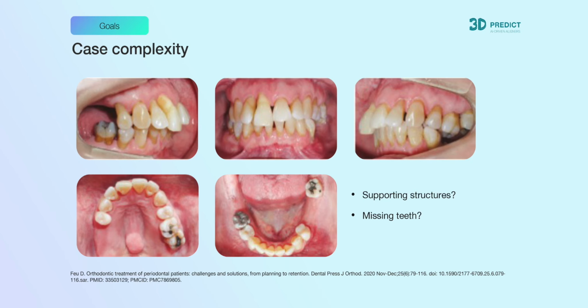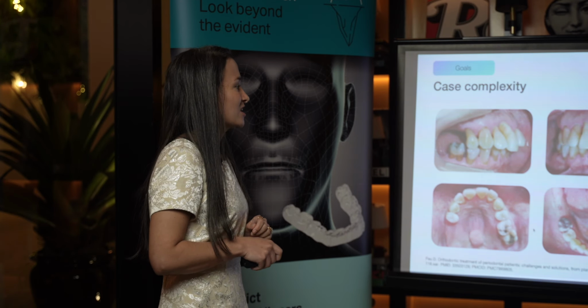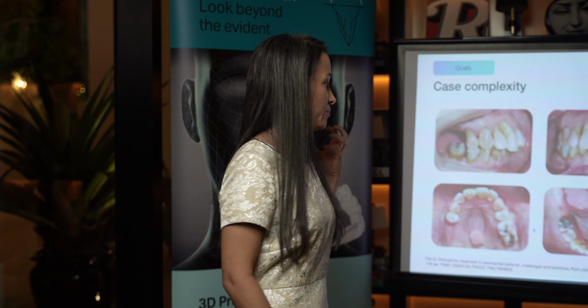So this is a perfect case example, and we're gonna talk about that later, where I highly suggest you submit a CBCT. Because without knowing how much bone is actually covering this number 8, without knowing how long this number 8 is, it's impossible for us to actually determine the center of resistance. And this is crucial for this type of patient when there is so much periodontal involvement.